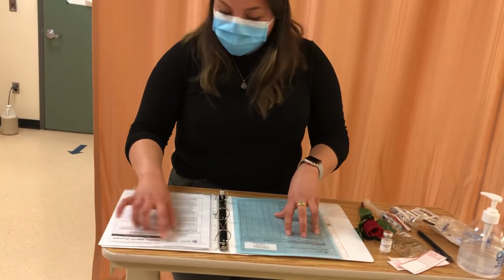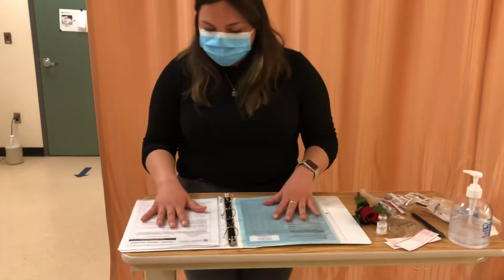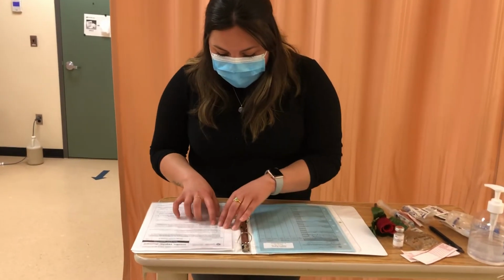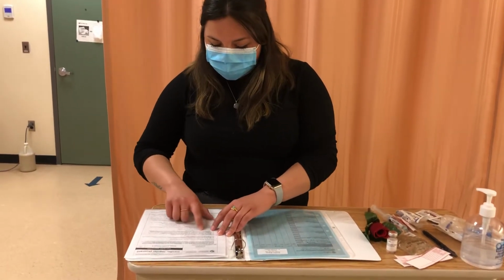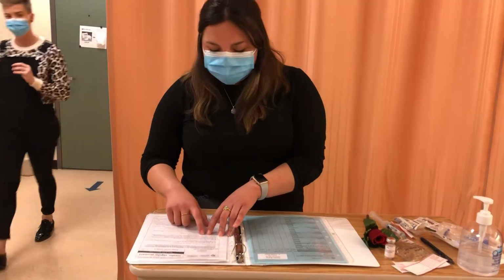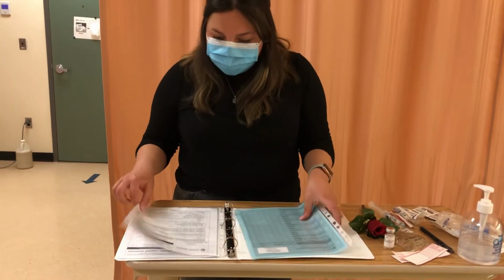So Insulin R. This is a high alert medication, so I'm going to need 2 checks throughout my preparation. This is an anti-diabetic. May be administered by a nurse or a student nurse through IV continuous. And it's important here to note that we need to have D50W on the unit, so I know where to find that in case my patient does have a hypoglycemic reaction. And I'm just going to keep going through.